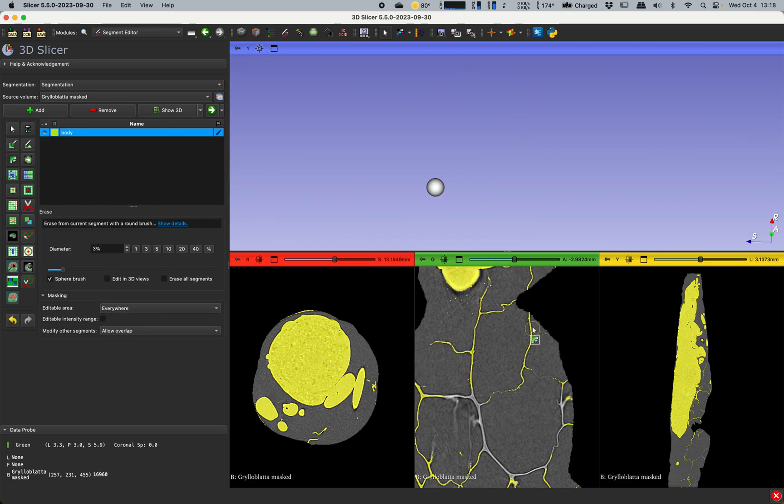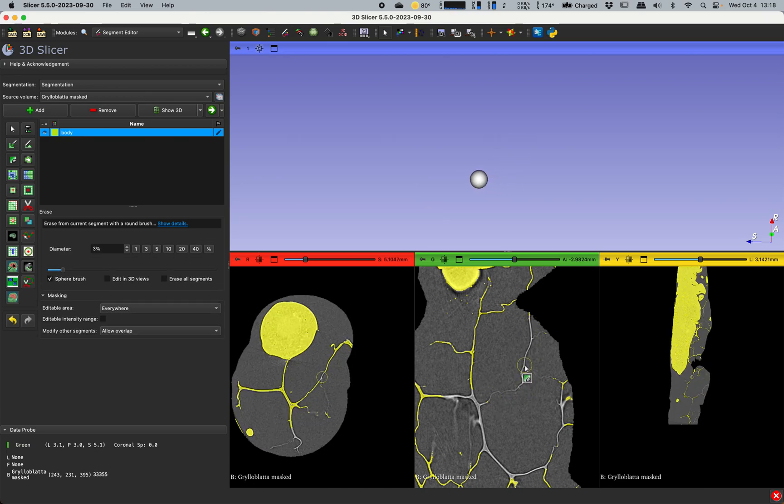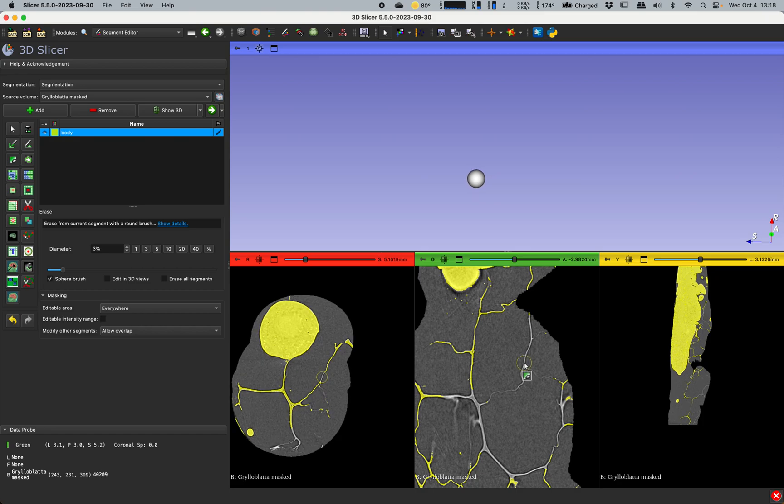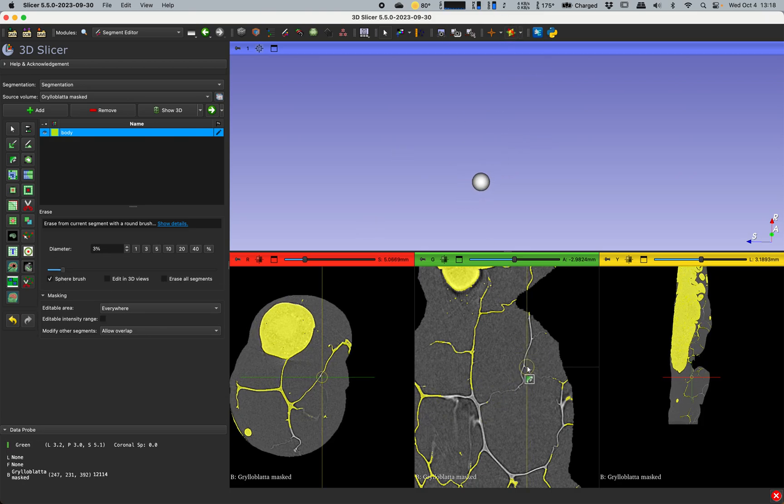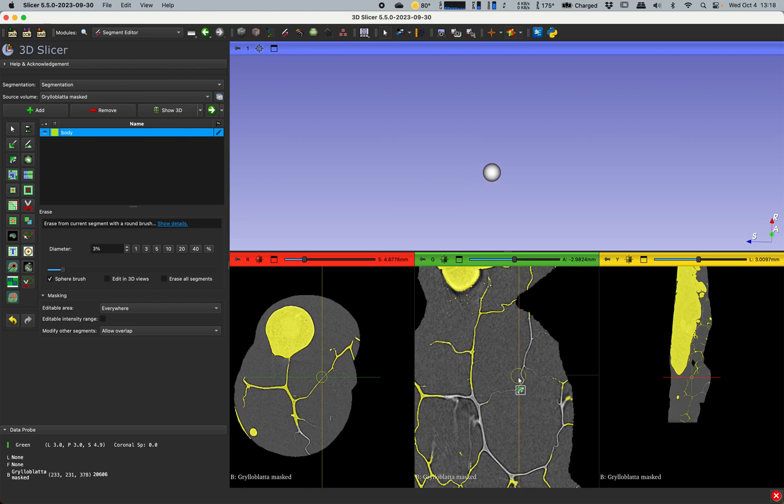One thing that's very useful to be able to see what you're doing here is turn on slice intersections. Hold down the shift key when you move the mouse around, you can see in all views where you are.